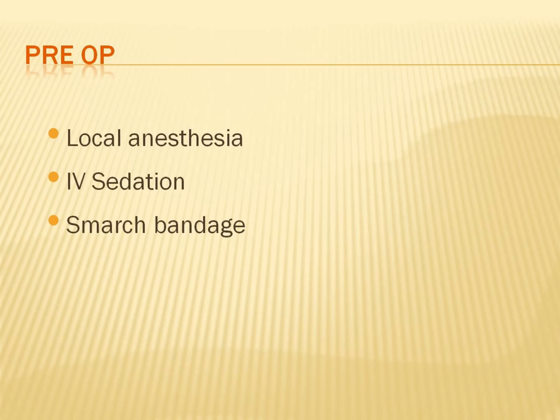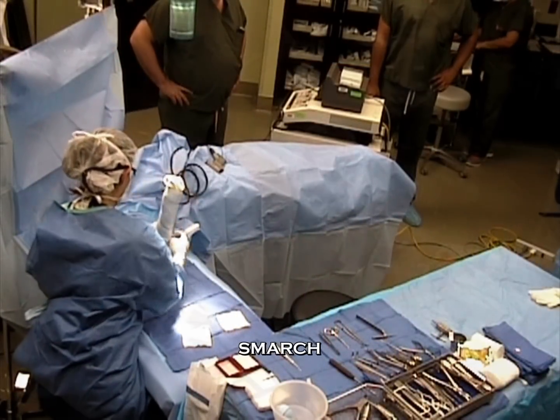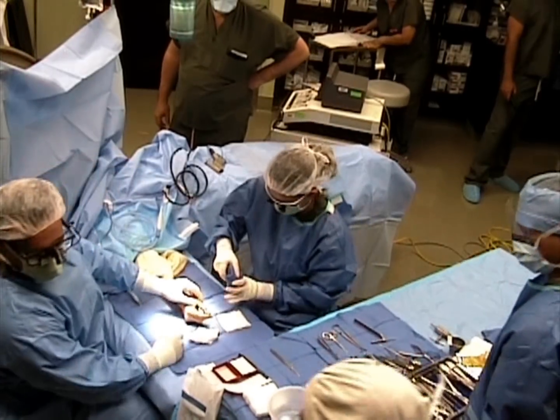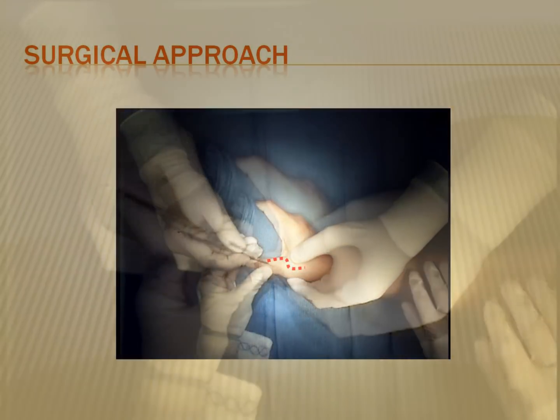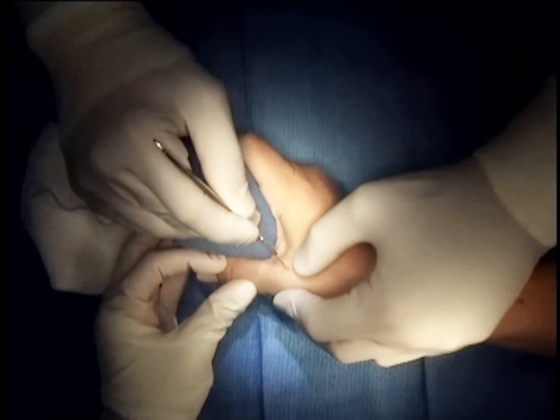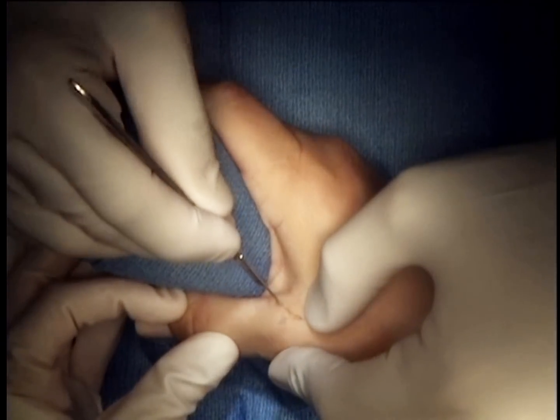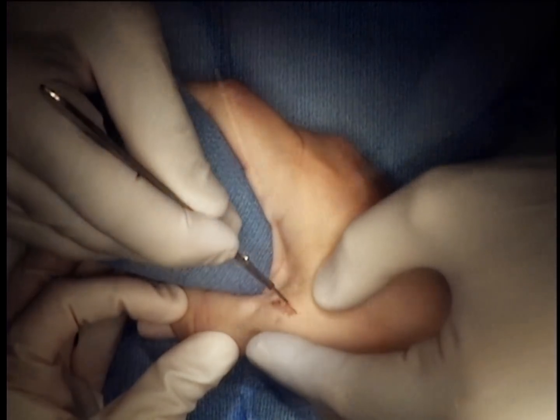This was done with local anesthesia and sedation. We exsanguinated the limb and used a lazy S incision that begins more dorsally proximally and then curves down to the palmar aspect in order to simulate the course of the collateral ligament, which usually passes in an oblique manner.